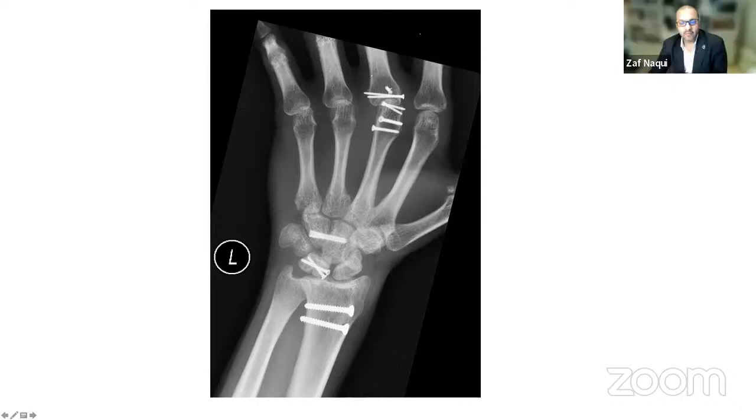Not every day. Yeah. And in terms of the fracture pattern for the radius, you've just gone across, you've treated it on first principles. There's a split fracture and you've gone across with two screws. I was getting the plate out and doing all this, and the registrar was with me, and they said, do you know what, you could just put a couple of screws across that. So they got the poor ham team, I think they were despairing of me by the end. I said, oh, could you get me the small fragment screw set out as well, please? So they got all that.